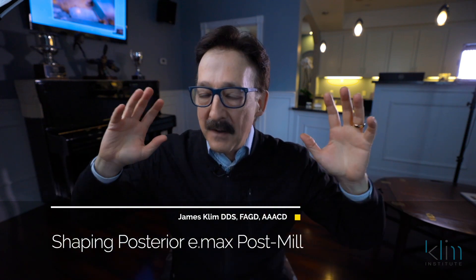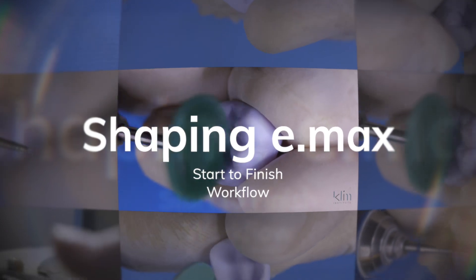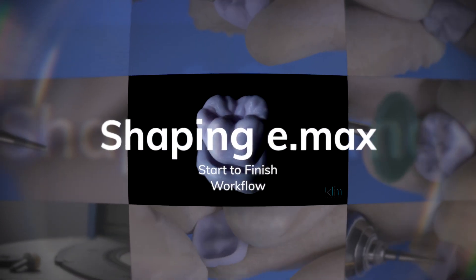Hi, I'm James. Let's talk about finishing E.max in the posterior arena. This will be a series of several videos on various finishing styles for E.max.